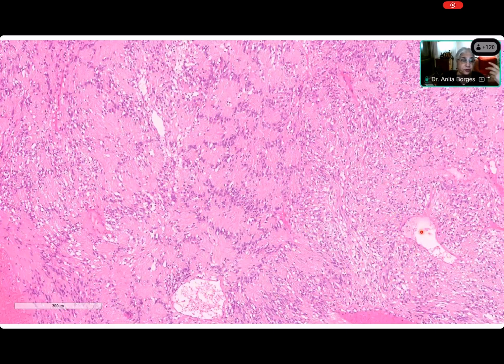So there are different kinds of change that can occur in schwannoma. One is cystic change. The other one is extensive hyalinization. You can imagine how this collagen will cause extensive hyalinization. And the third is hemorrhage. These are the three changes. Of course, people talk about degeneration. It's not. And when you get a lot of these kinds of changes, the Schwannian part of the tumor is very paucicellular, or it is seen in different areas, maybe only near the capsule or in the center.